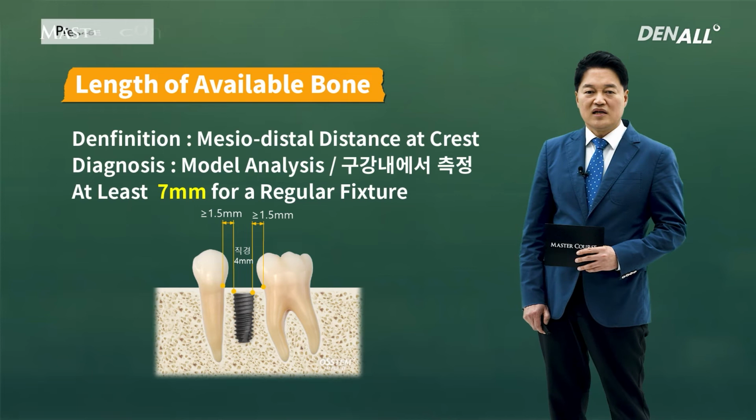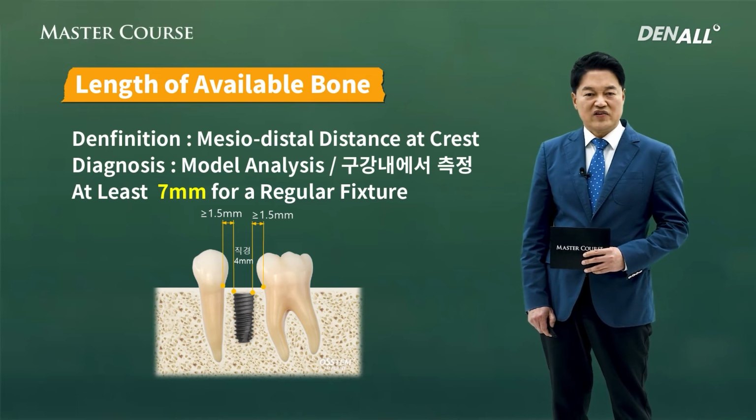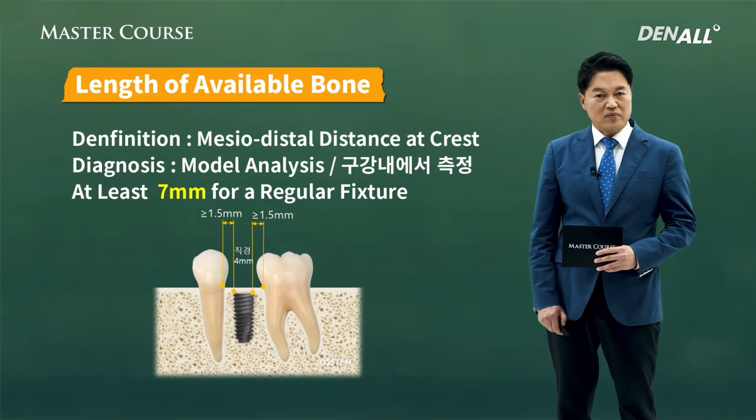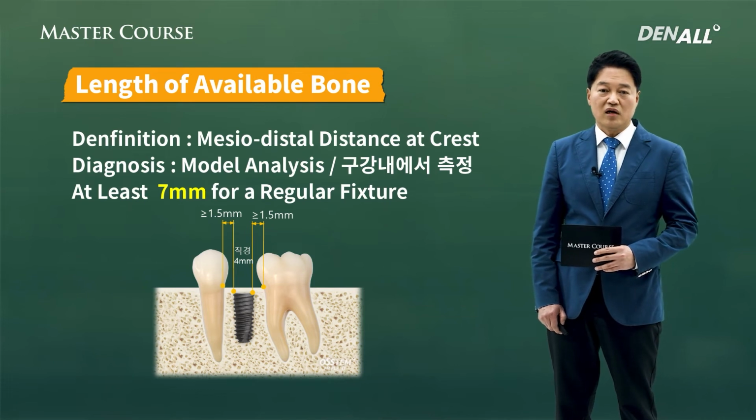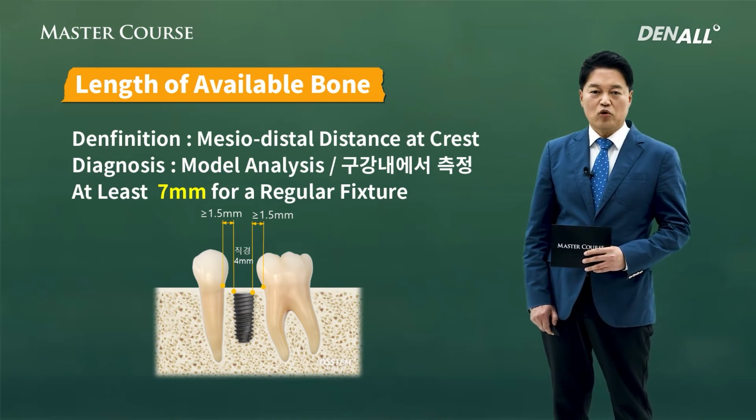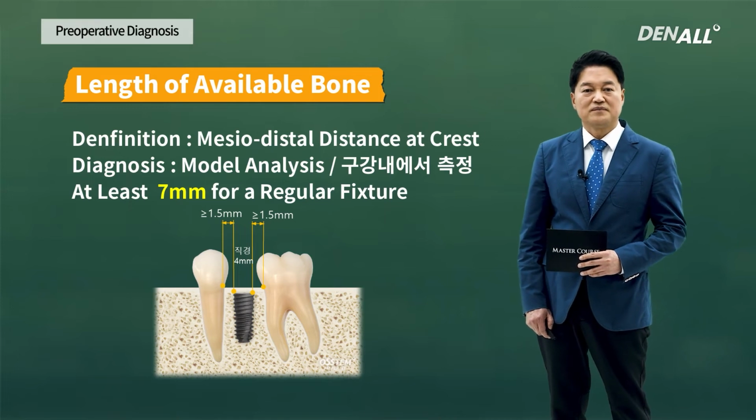If you are going to place a 4 millimeter diameter fixture on both sides, you need to have 1.5 millimeter. So a total of 7 millimeter of mesiodistal distance is required. If you're going to place a diameter 5 millimeter implant, the mesiodistal distance needs to be at least 8 millimeter.